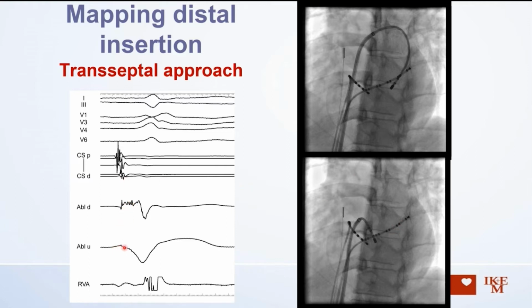Again, there is this QS in the unipolar signal, and then you can see that there is an atrial component and some funny thing in between, and then there is this ventricle electrogram. So this would also be a good spot.